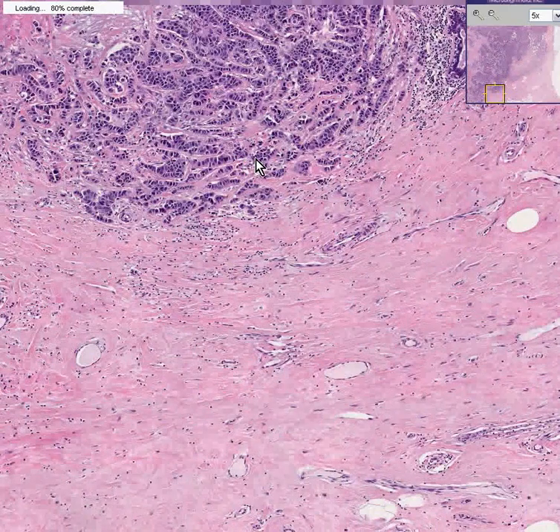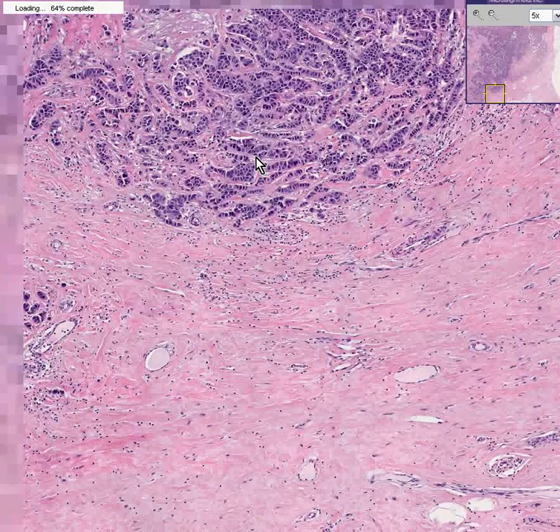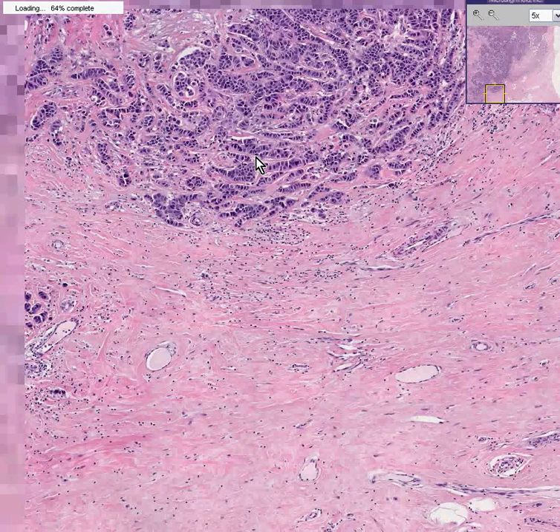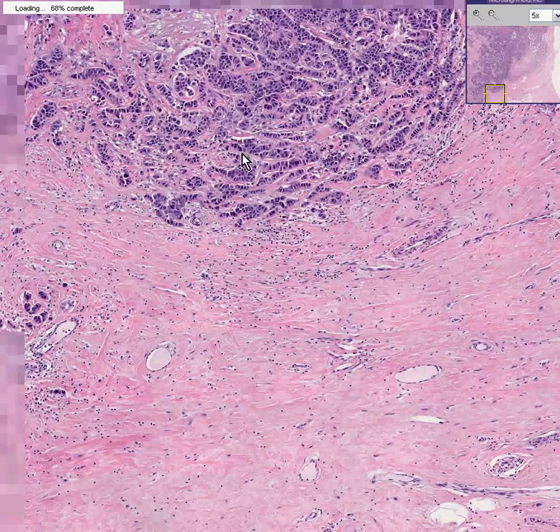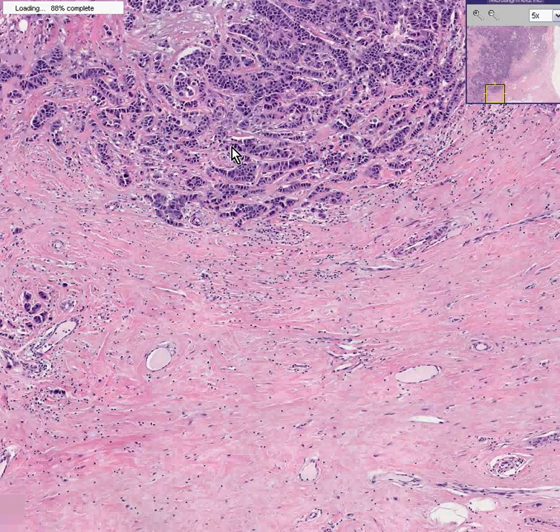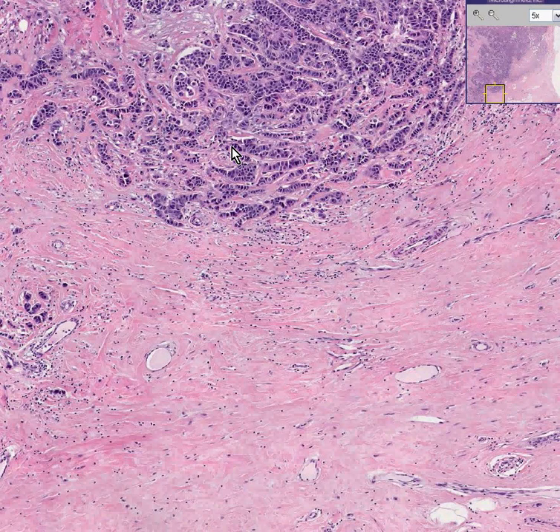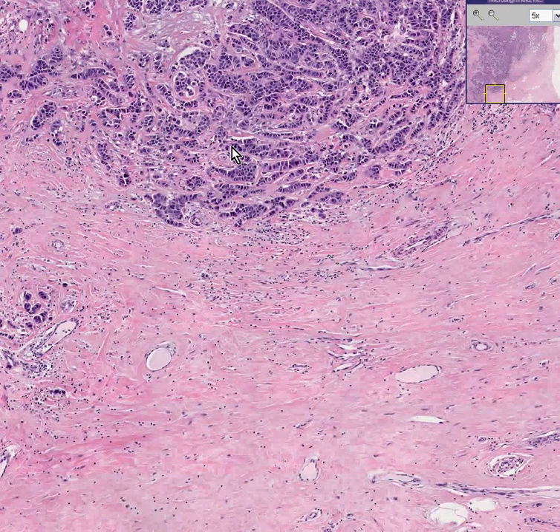All of the cancers of the breast are adenocarcinomas because the breast is a gland. And almost all of the breast carcinomas are also what they call ductal carcinomas, because the vast majority arise from the ducts rather than the acinae.